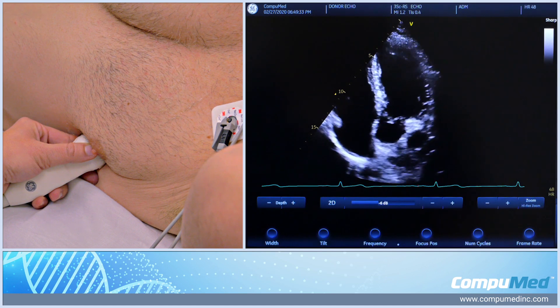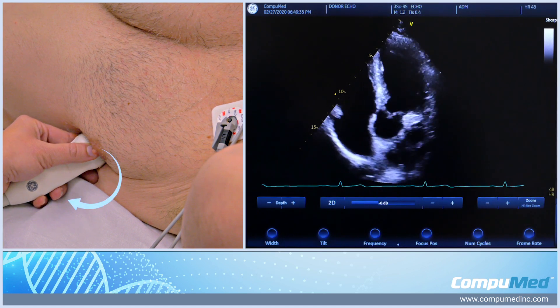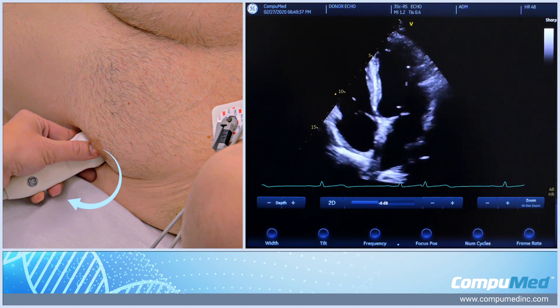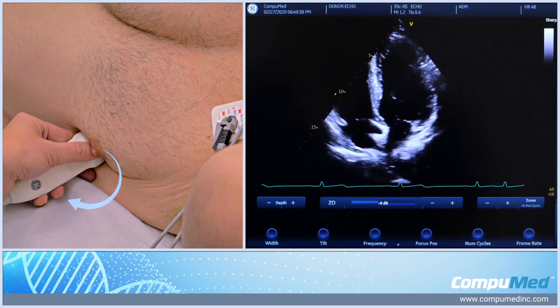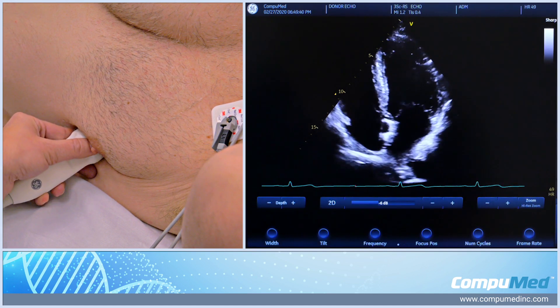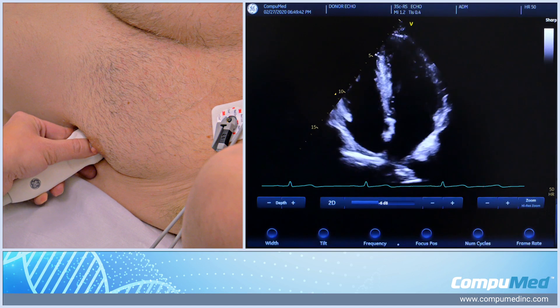To go back to apical 4, I'm just going to rotate my transducer clockwise back to 3 o'clock and angle the transducer back down inferiorly.